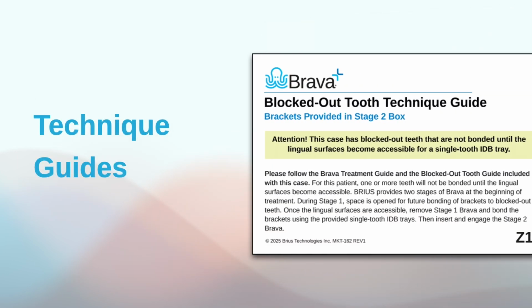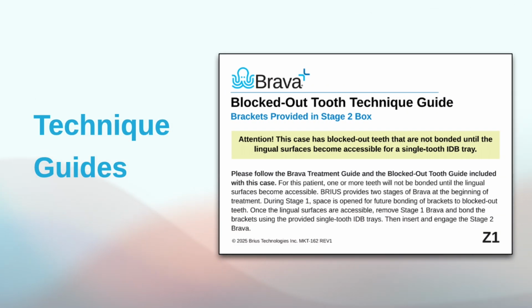Some cases have unique clinical conditions where a technique guide is beneficial. A printed technique guide is provided in the Brava Patient Kit when these clinical conditions are present. Some cases may have more than one technique guide, or none at all.